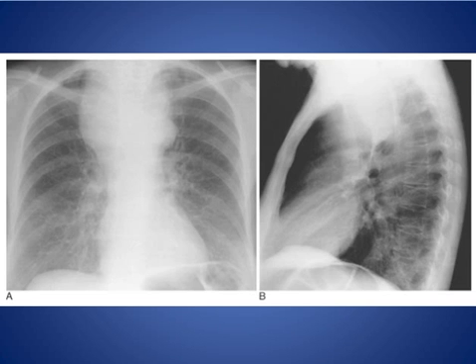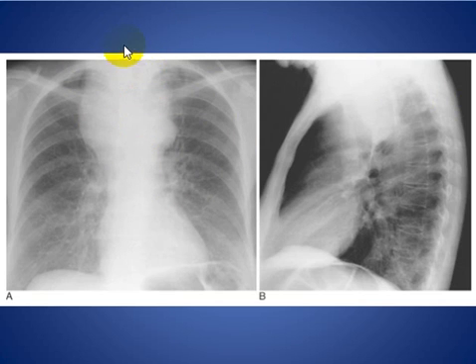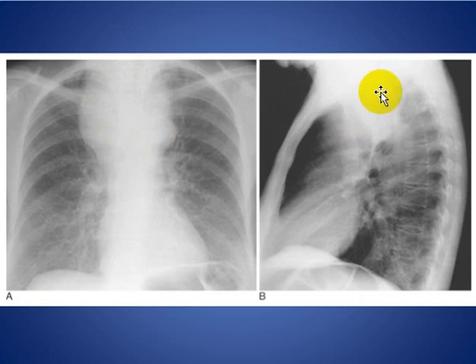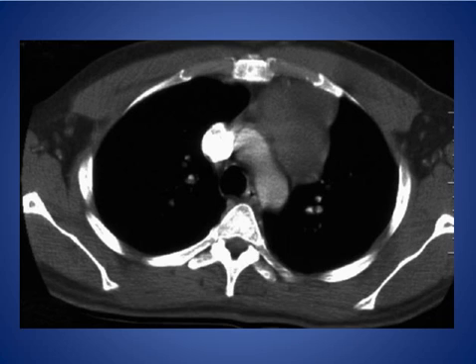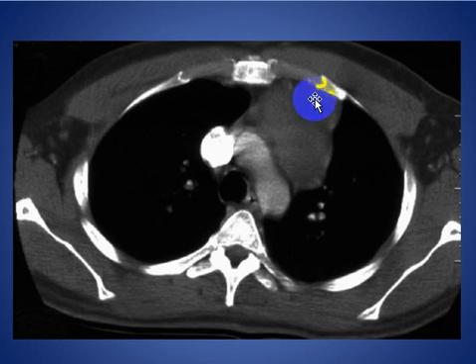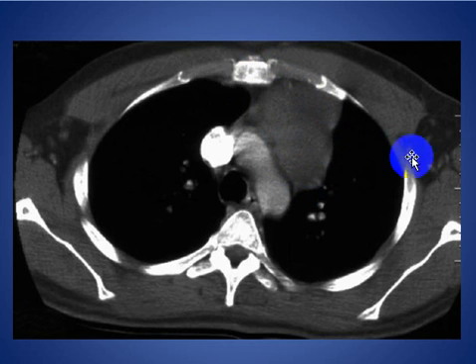Here you see a mass lesion in the superior anterior mediastinum extending from the neck to the superior anterior mediastinum, representing thyroid gland enlargement. Here is another mass in the anterior mediastinum, midline to the left side — this is a thymoma.